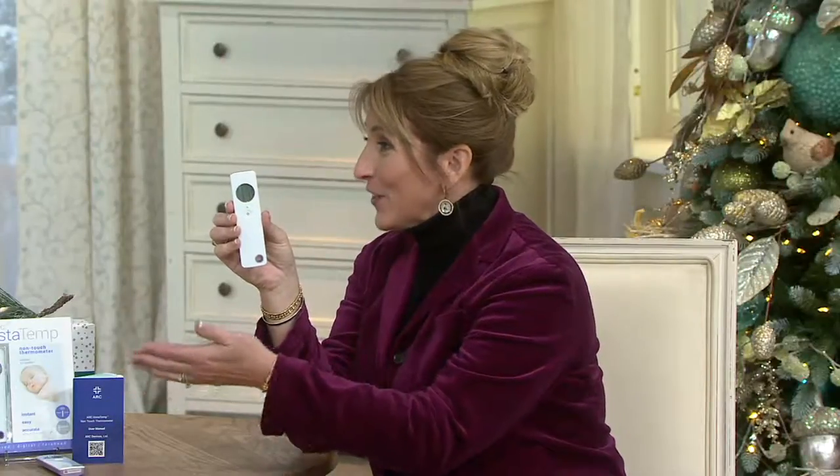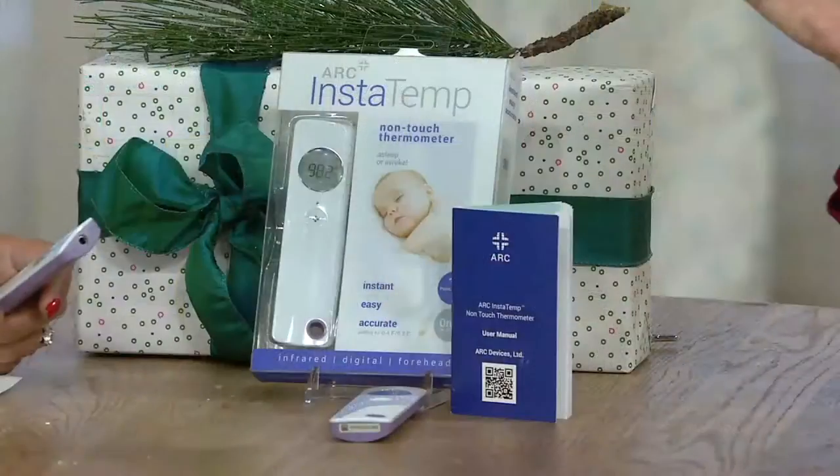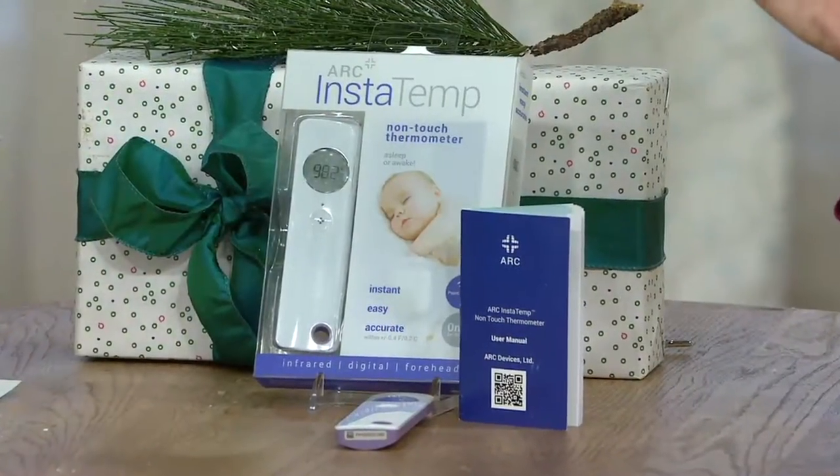If your little boy gets sick, you're not going to get your little girl sick just because you shared a thermometer. And it's so easy to use at $34.92 — almost too easy. Some people have used it and they're like, am I doing it right? It's so simple.